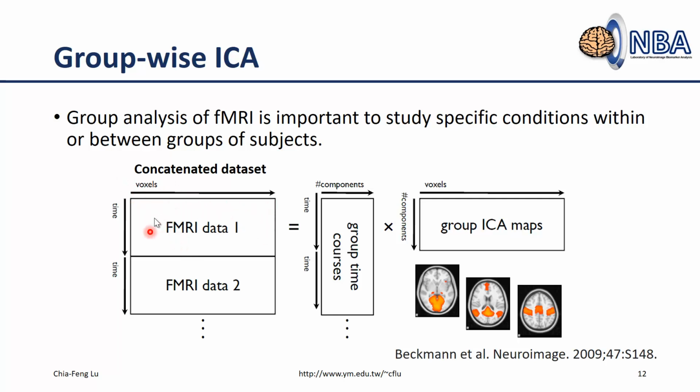So you can see we will transform the original image-wise fMRI data into this kind of a matrix, where rows represent time and columns represent the voxels. You may have over 10,000 voxels right here, okay?